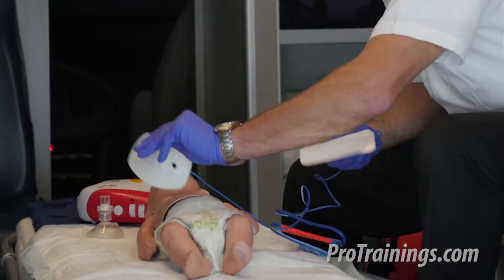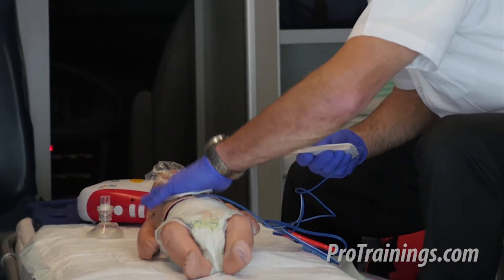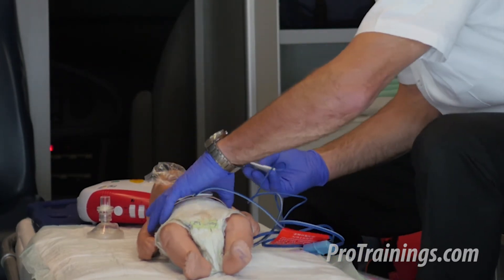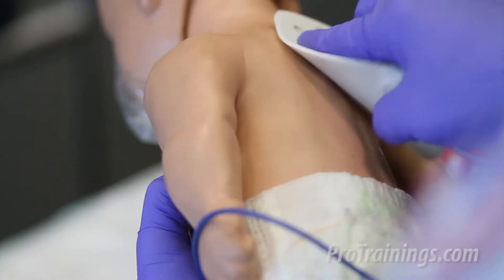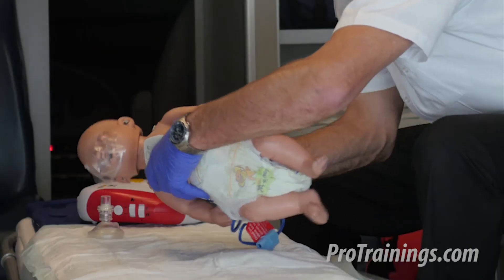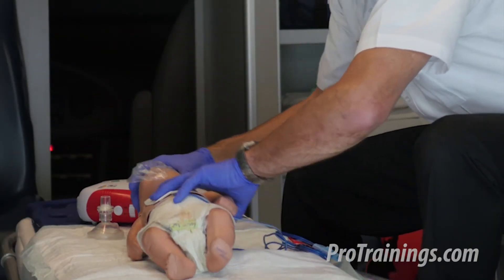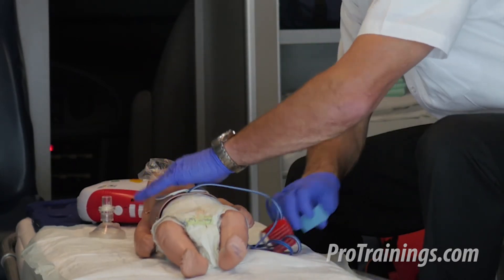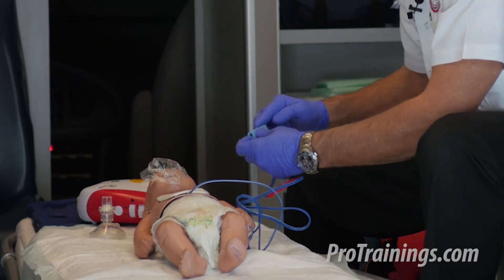I now attach one of the pads to the front of the chest, and the second pad to the back of the baby. Remember, with a real baby, we're going to be rolling them to their side to attach the pad, then rolling them back, making sure both pads are firmly pressed onto their skin.